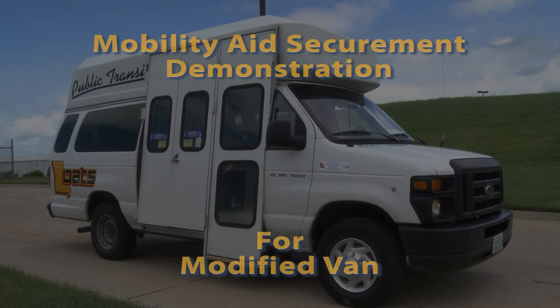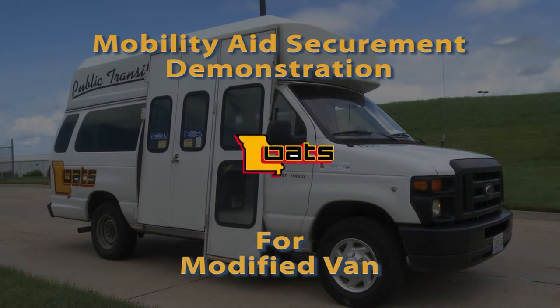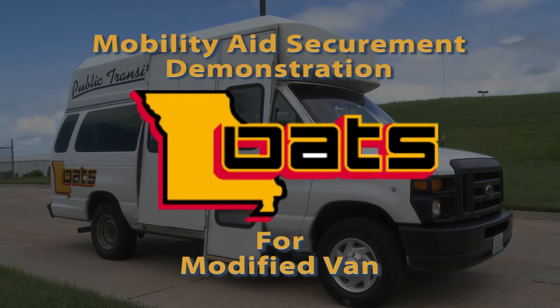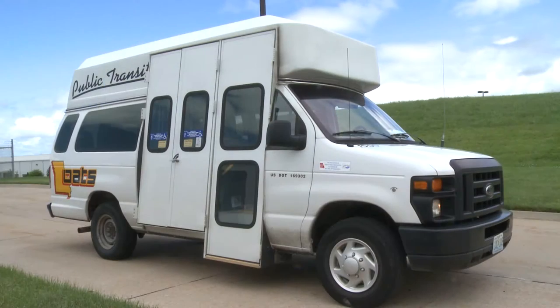I'm John Rice with Missouri R-TAP and this morning we're going to do a wheelchair mobility aid securement demonstration for the OATS organization. Today we're going to do a modified van. We've got Ashley — she has secured her mobility aid in a proper location.